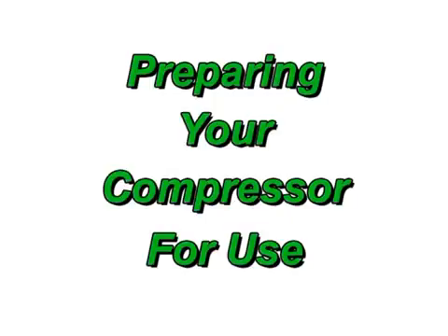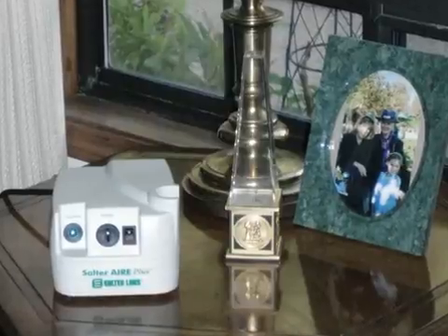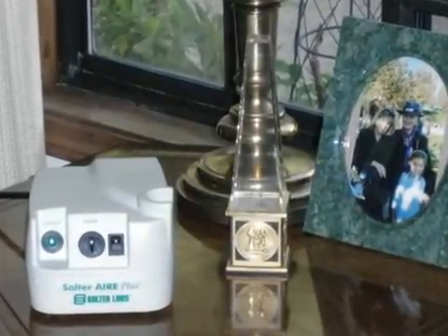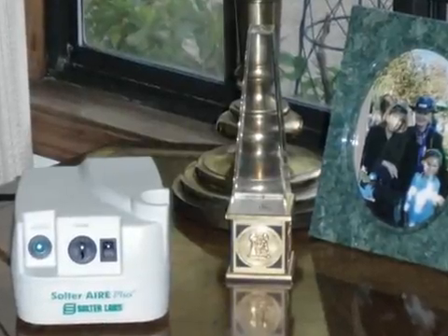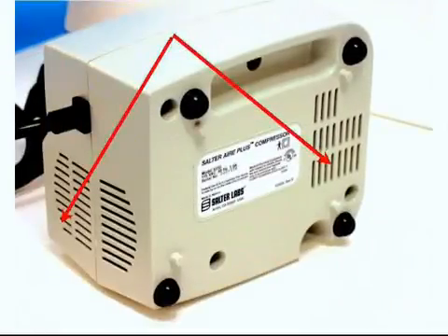Preparing your compressor for use. To start, place your Salter Air Plus compressor on a hard, flat surface, such as a tabletop, near an electrical outlet. Make sure that the air vents on the bottom and back of the compressor are not blocked. Never set the compressor on a pillow or padded surface that could interfere with airflow to the unit.